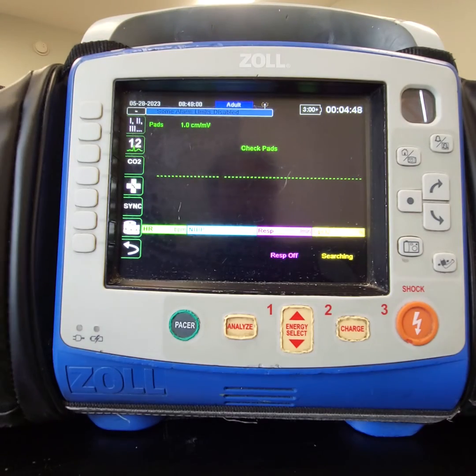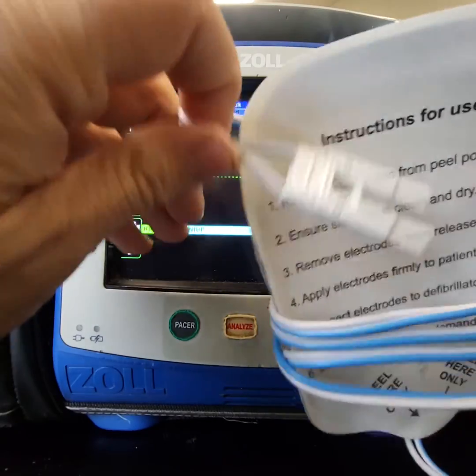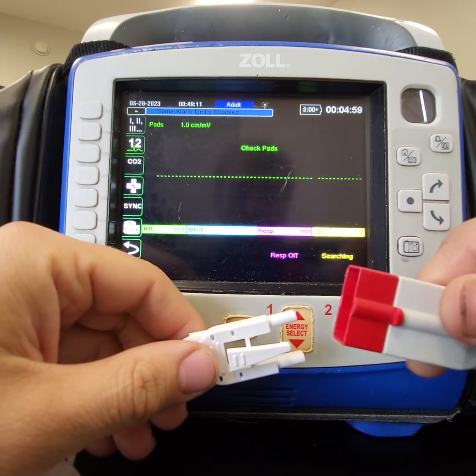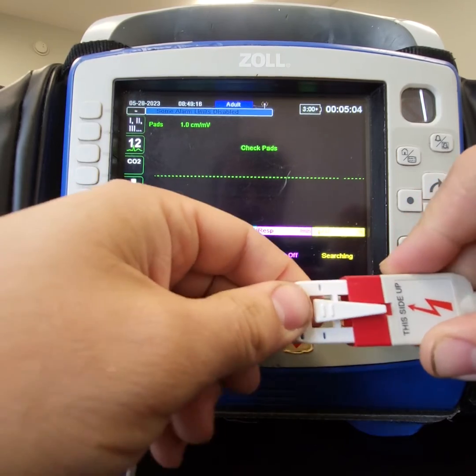When you get these pads out they look a little bit like this, and they have a very familiar connector here. This connector is for this guy. You can see this side says 'this side up' — that's the little latching tab where we'll put that together.